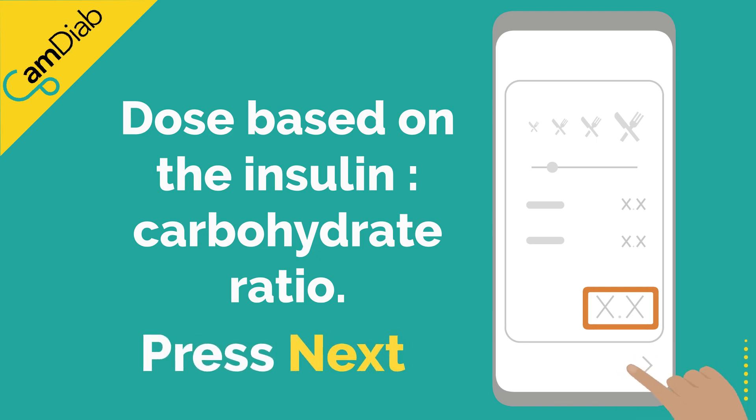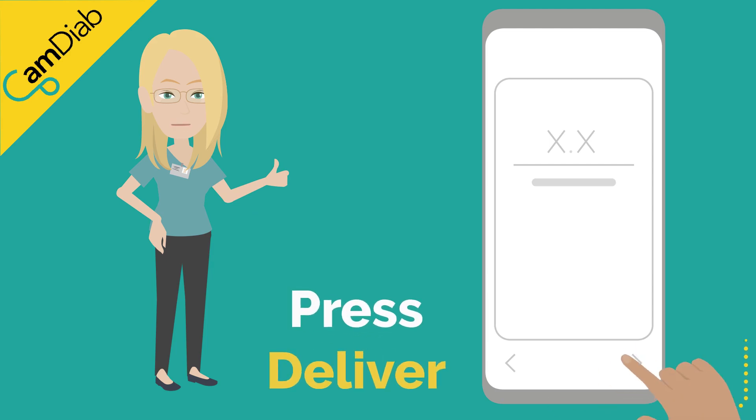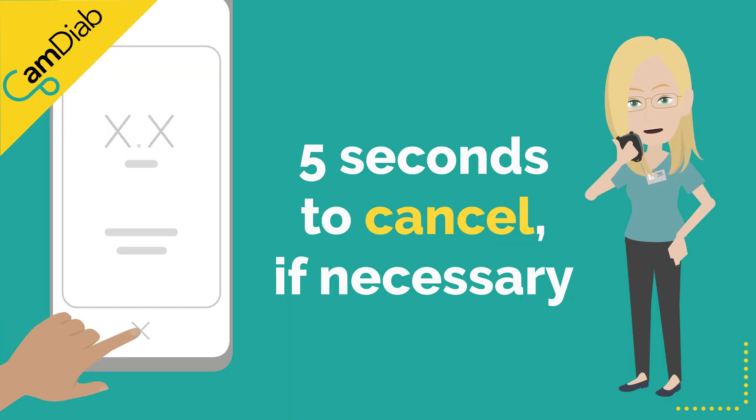Press next. If you're happy with the insulin dose, press deliver. You have 5 seconds to cancel the dose if you suddenly discover you have made a mistake.